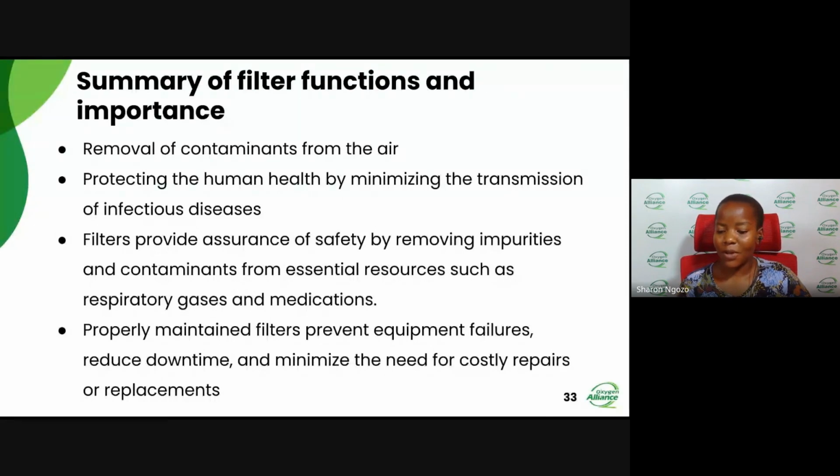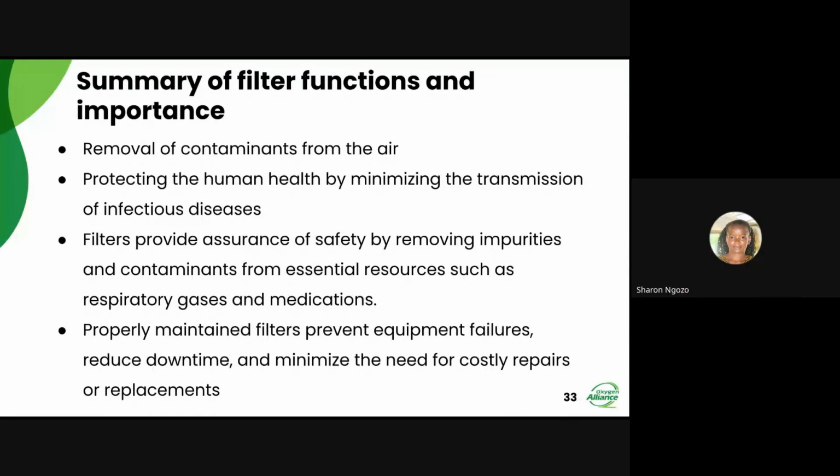As we're waiting for the comments and questions, we have a question from our Facebook page. The question reads, why should we place the air intake filter in a shady area and not under the sun? So that question is to you, OpenO2 engineers or any other person who can take this for us, please come off mute and take the question. Yes, Jen, you can take the question.